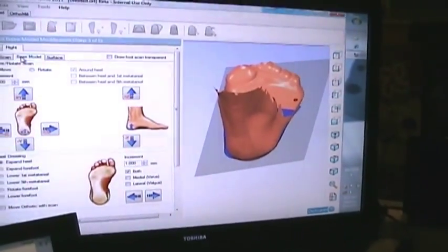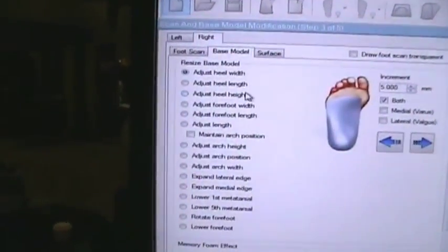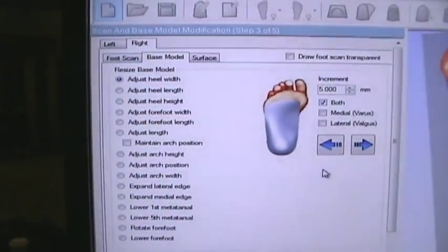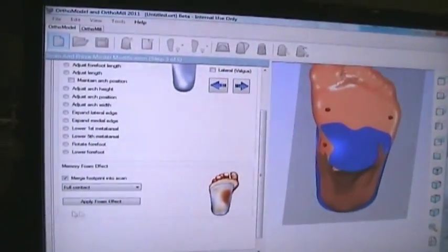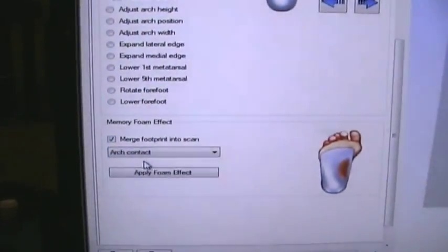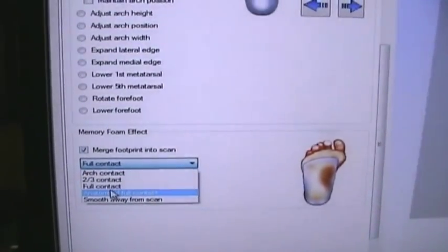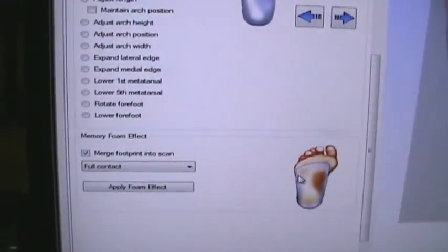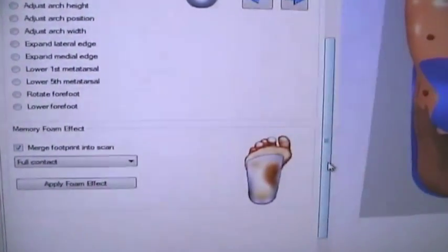We can also work with the orthotic by modifying every single aspect of the design, such as adjusting the heel width, forefoot width, arch position, and controlling the medial and lateral sides by adding millimeter increments. The most important option on this page is the memory foam effect — how the orthotic is going to touch the patient's foot. Options include arch contact, two-thirds contact, full contact, and anatomical full contact for EVA orthotics. I'm going to select full contact, where the orthotic has the exact same shape as the foot scan, but the software offsets the edge to allow for fat tissue expansion.